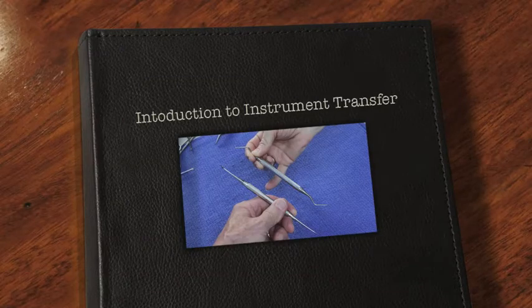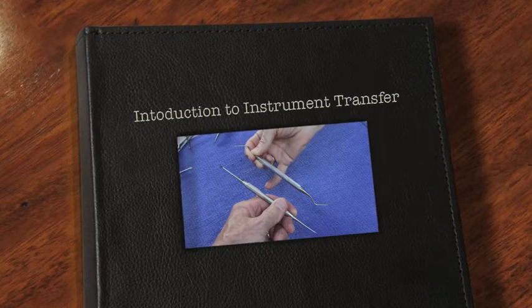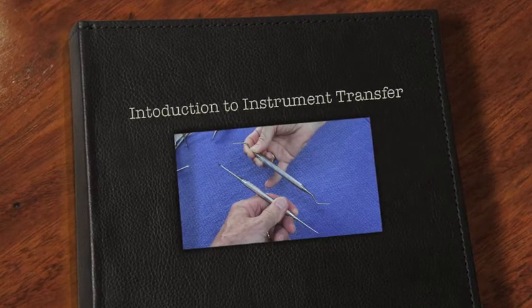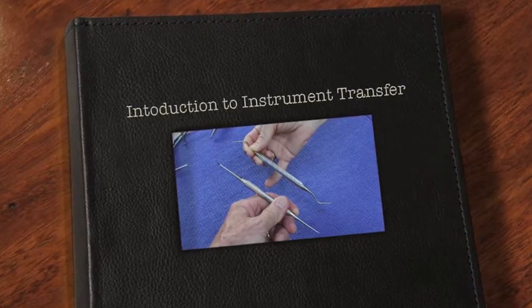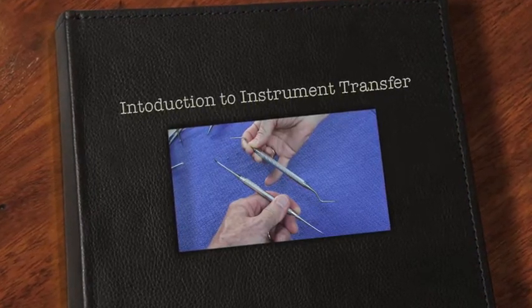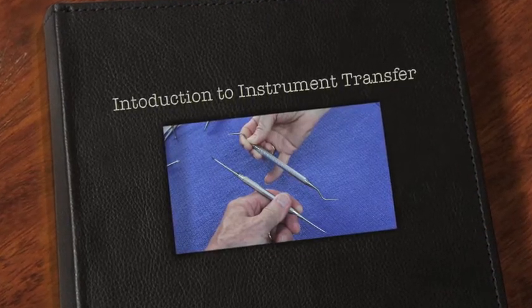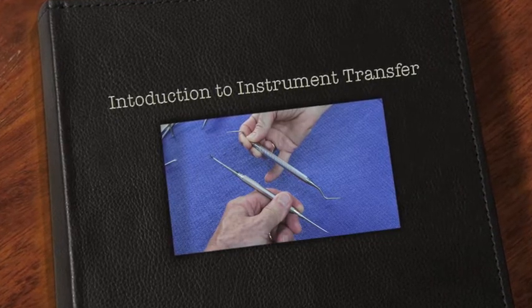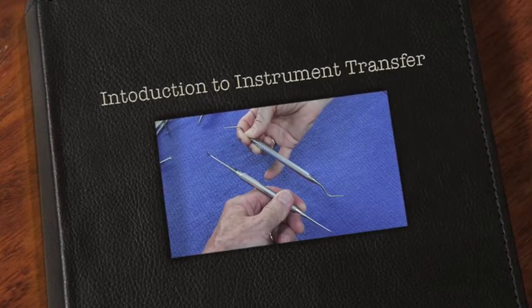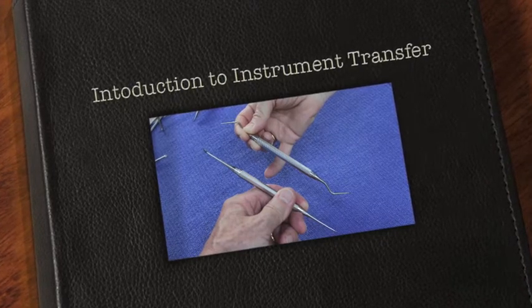Welcome back to our continuing series on the topic of dental assisting for the non-professional volunteer dental assistant. In this video, we will be explaining the fundamentals of instrument transfer between the dentist and his or her dental assistant. The purpose of this practice is to enable the dentist to use a variety of dental instruments in an orderly fashion, and most importantly, to allow the dentist to concentrate his or her focus on the work in progress. In this way, the dentist can complete the required tasks in a timely fashion, thus maximizing his or her clinic time while meeting the patient's needs most efficiently.